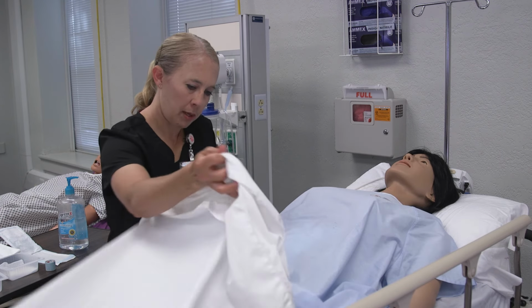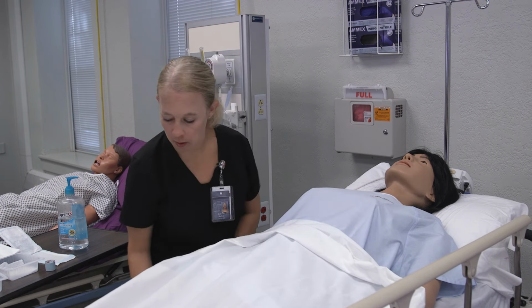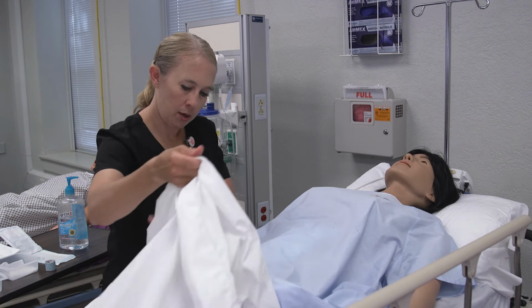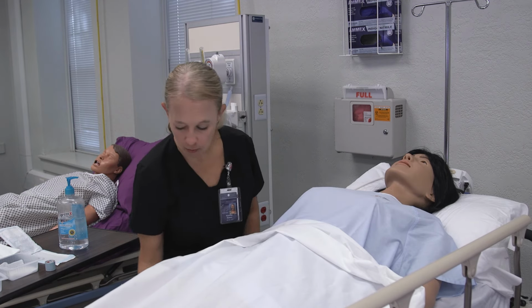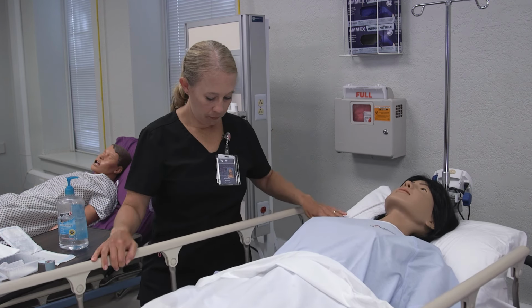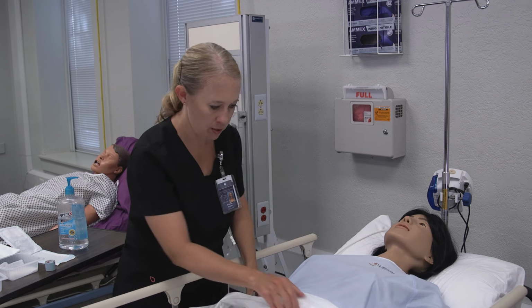Ms. Wilkins, I'm just going to get you covered back up here. We are all finished. I'm going to put your side rail up and then I'm going to lower your bed. Return the bed to its lowest position. Raise the top side rails and verify that the call light is within reach for the patient. And I'm going to put your call light right here by your hand so you have it if you need to call us.